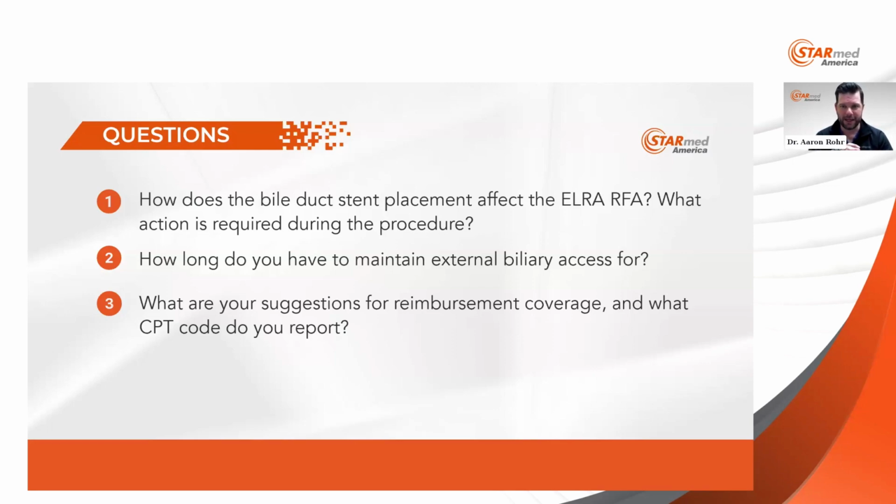How long do you have to maintain external biliary access for? Again, this is just my experience. The external biliary access trial is only a few days, so 3 to 5 days, depending on weekends and where people line up and how well they do. We specifically cap them in that trial, so they are capped external drains, where we say, all right, are you going to do okay for these next 3 to 5 days? And if you are, then we're okay to just remove those.